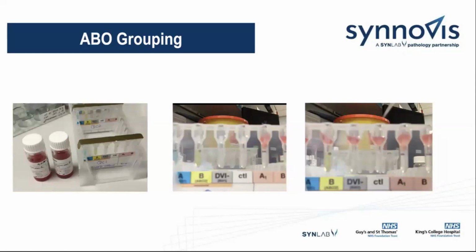So this is an example of the test being done manually. As you can see, we use the same cards. And in the forward group, the cards contain the anti-sera with the antigen that it's labelled with. So you can see the A, B, the D control. And this card is an example of direct agglutination technology, and we're looking for IgM antibodies. As the antibodies are large and work at lower temperatures, we don't need to incubate this card. So once the sample has been dispensed into the card, it can be centrifuged and we get a result. So you can see on the first picture, we've got the reagents as well that we use for our reverse group.